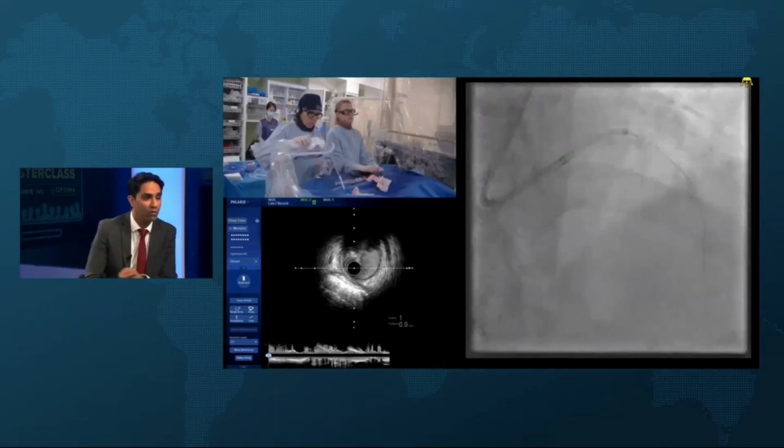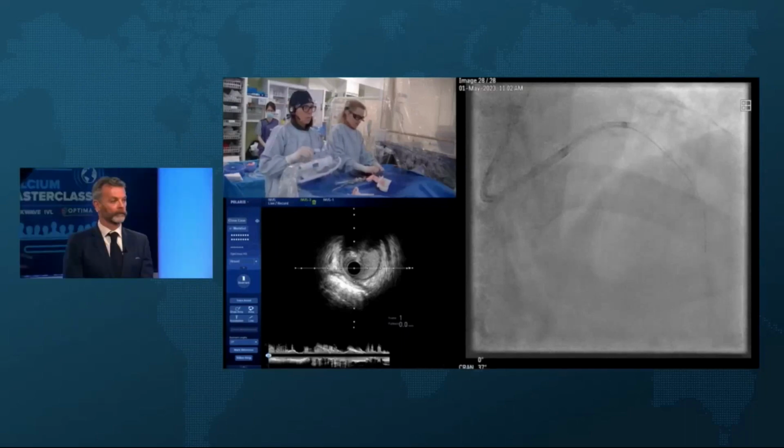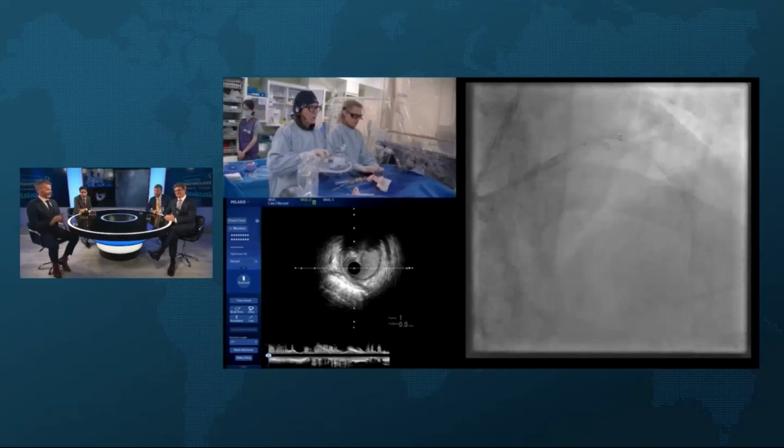However, to your point, then you have a scaffold in the way, and with a much bigger artery, I often will use that one-to-one NC, especially when my Shockwave was a bit undersized. Personally, but it's a kind of pacifier, isn't it? In US terms. 100%.